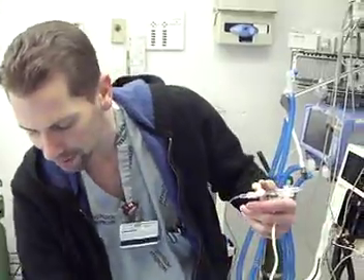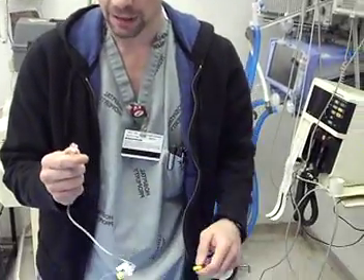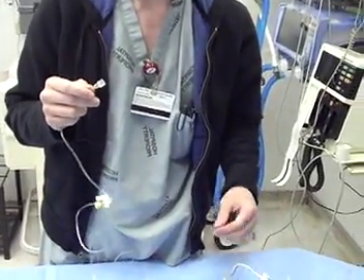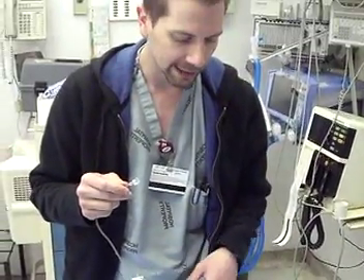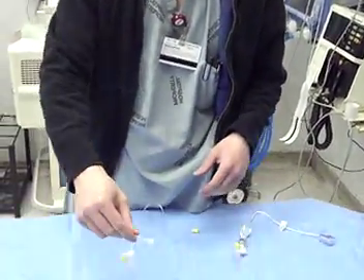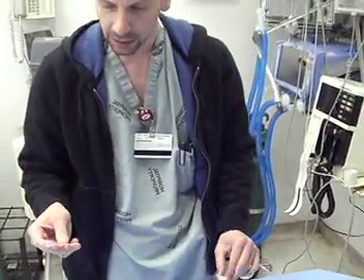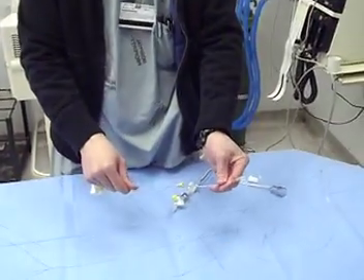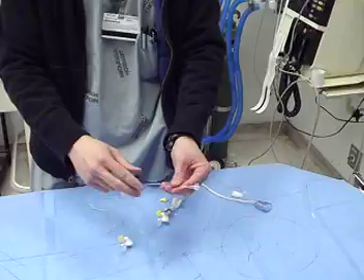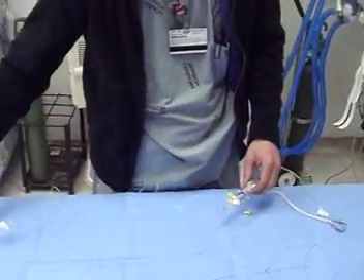Now if you actually have a patient you want to do CVP monitoring or A-line monitoring on, you're going to take off the yellow cap at the distal tip and plug it in either to the distal port of your central line — which would be the brown port here at Elmhurst — or plug it into your A-line. At that point you can even flush the central line or the A-line, and you're good to go. That can be secured with sutures if it's an A-line, or just left for a central line. Now you're actually ready to start monitoring the patient.